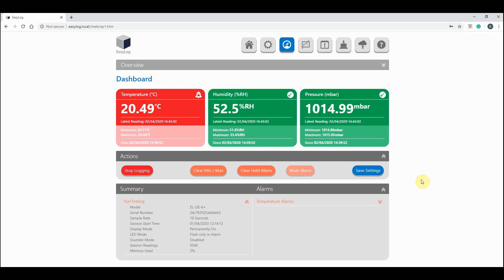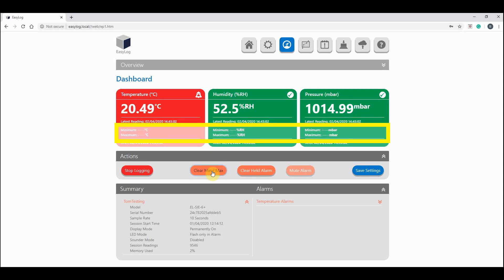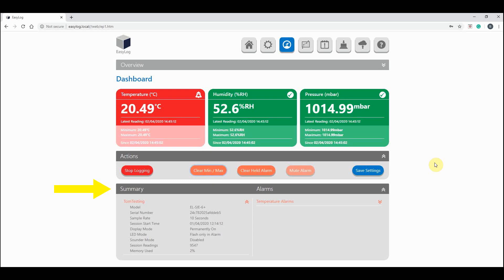I'm going to clear the min and max readings now to show you how that looks. We also have this summary section which provides a brief overview of your device, its configuration, as well as letting you know how many recordings you have and what percentage of memory you have used.